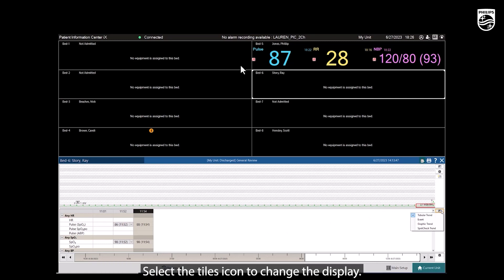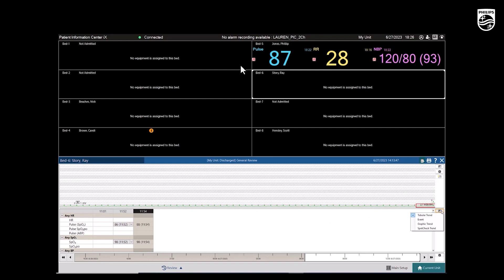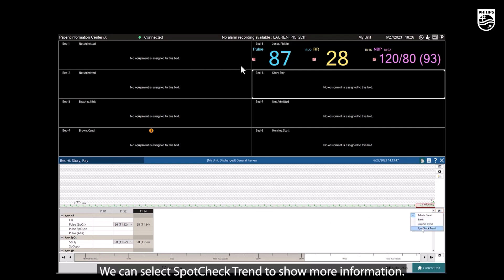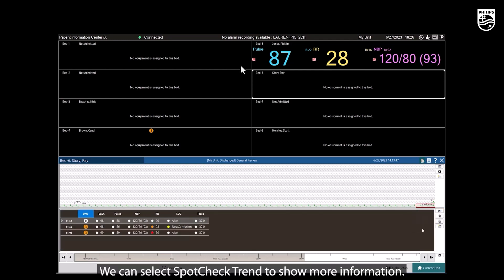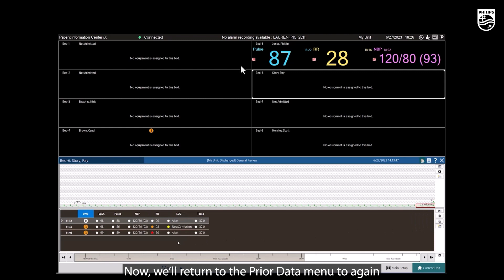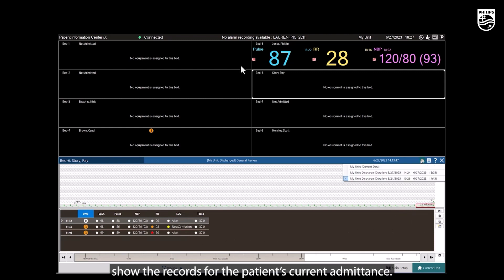Select the Tiles icon to change the display. We can select Spot Check Trend to show more information. Now, we'll return to the Prior Data menu to again show the records for the patient's current admittance.